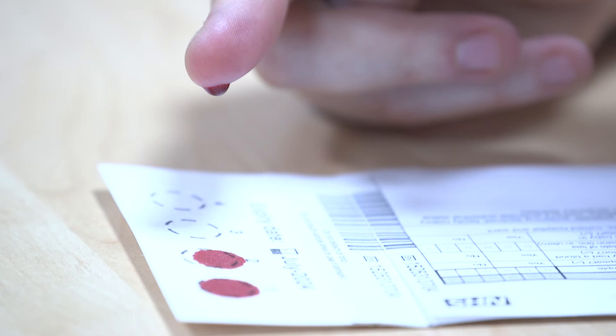Let the blood form into a drop and then let it fall onto the card. Let two drops of blood fall into different circles on the card. If any blood droplets overlap or do not fill the circle, then do another spot. Blood spots should fill the circle but should not be double spotted. Samples are commonly rejected because the spots are too small.